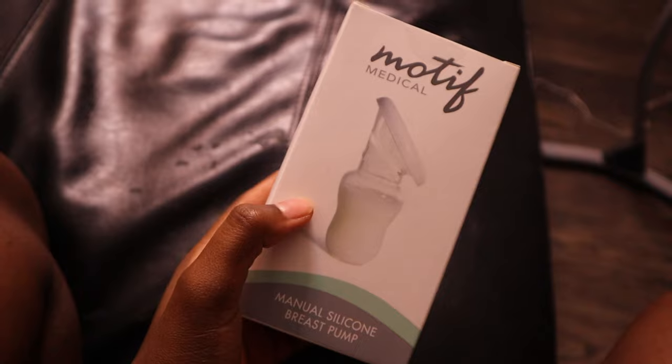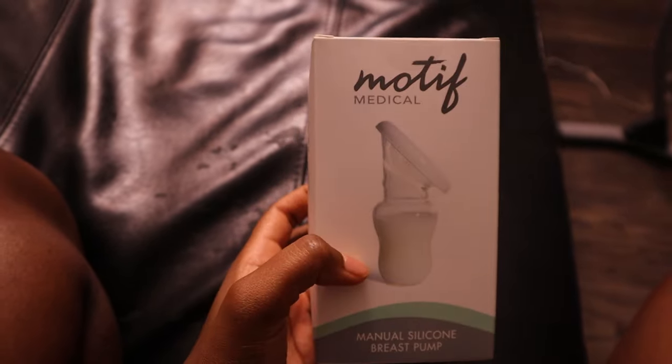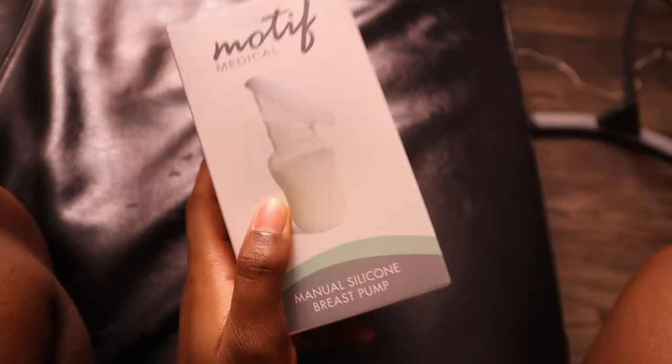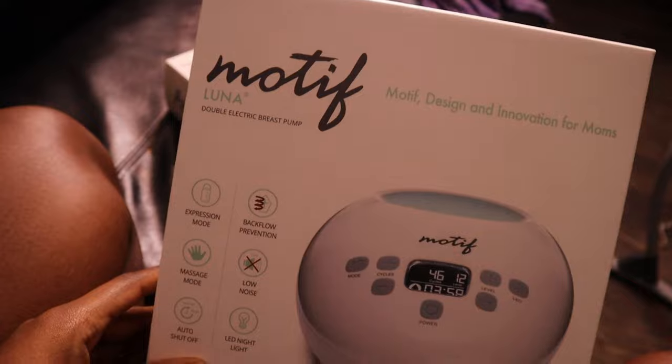I'm trying my best to look at the lens. Okay, so let me flip the camera over so you guys can get a better view and I'm gonna unwrap it for y'all. So they gave me this manual silicone breast pump — it's like the Haakaa. I am really excited about this. If you know what the Haakaa is, you get it. And then this is the actual electric breast pump.